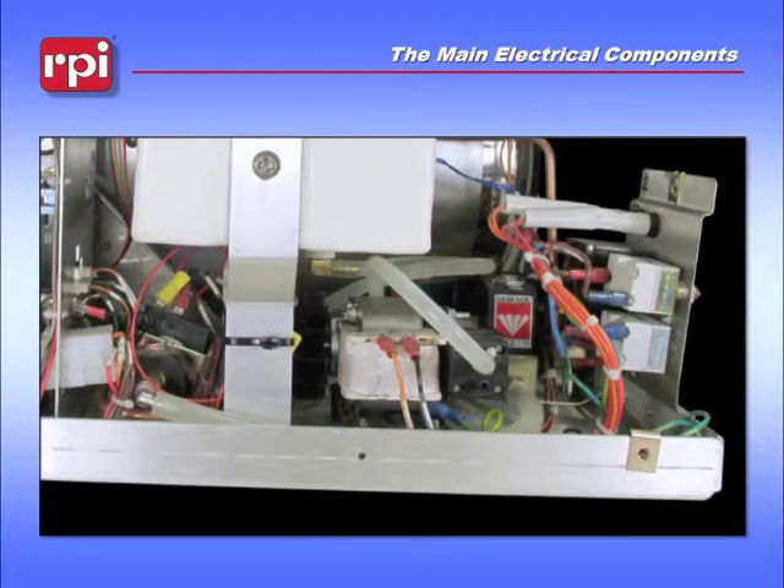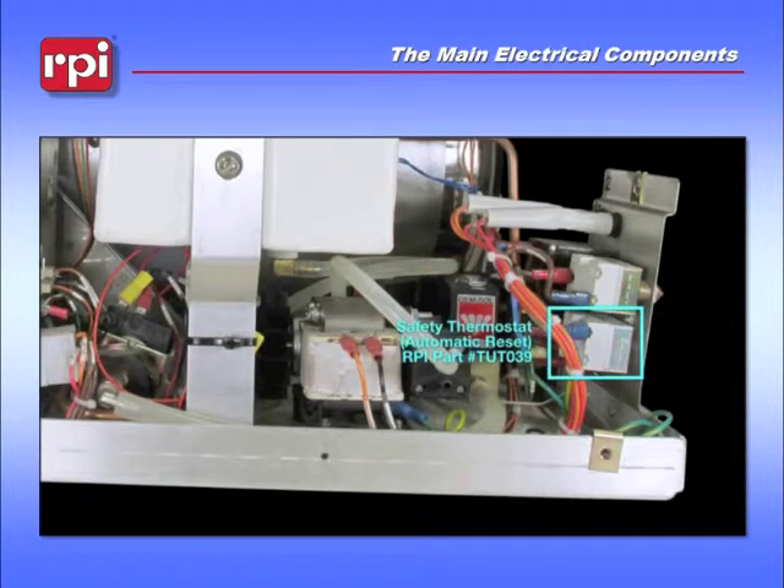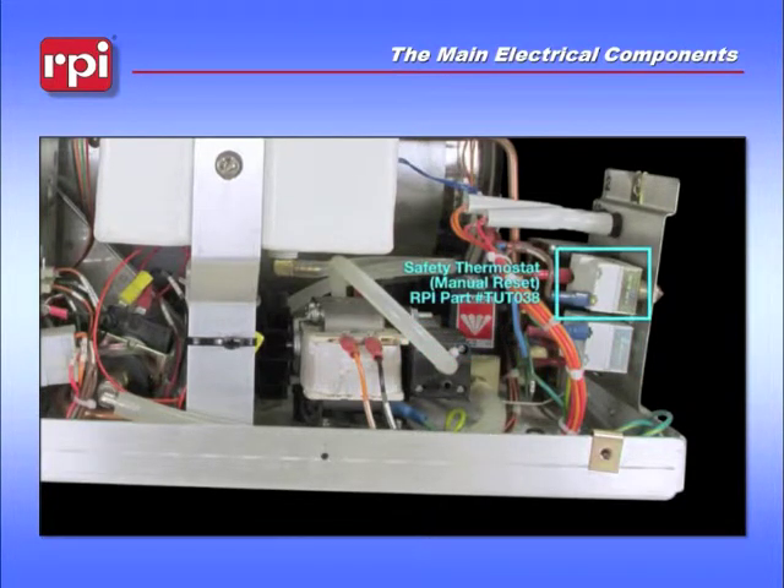Hidden just to the right of that is your fill solenoid. Just to the right of that, on the bracket, is the automatic reset safety thermostat. And just above it is the manual reset safety thermostat.